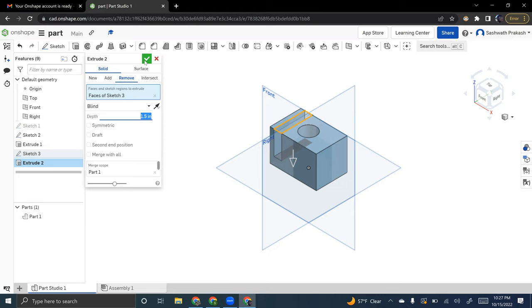So really what I told someone else was, I just moved it around, to be honest. I went to front, and I literally flipped it over. That's the easiest way. Obviously, when you're cutting, you want to make sure it's the right face that you're cutting out. This works. You can't use these three features anymore because it's going to go back to that, but at least you can play around with it better.